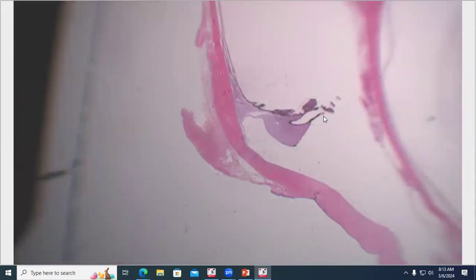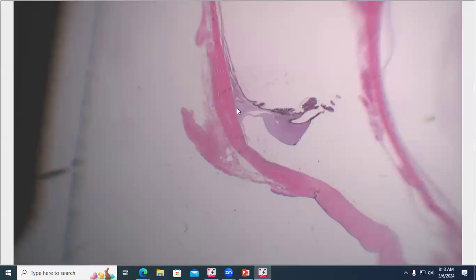And then when we look at the gonio slice, here's a more recognizable iris. It is abnormal, however, because basically the iris is separated from the sclera, because the ciliary body and its plicae actually look like they are lining the back of the iris. So that's abnormal. This is an area where the iridocorneal angle is recessed. So, iridocorneal angle recession. In addition to that, we can see that the iris epithelium really does extend around into the front of the iris here. And overall, the iris has an abnormal contour.